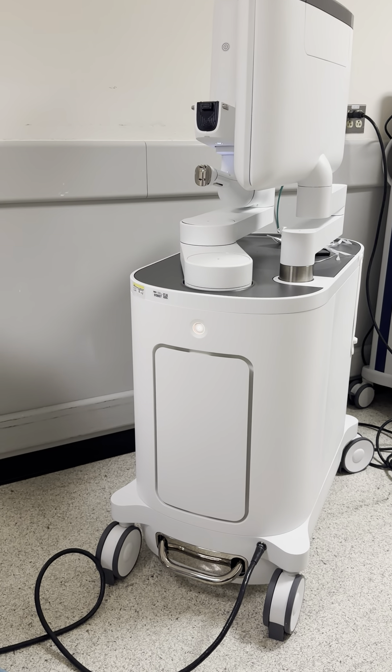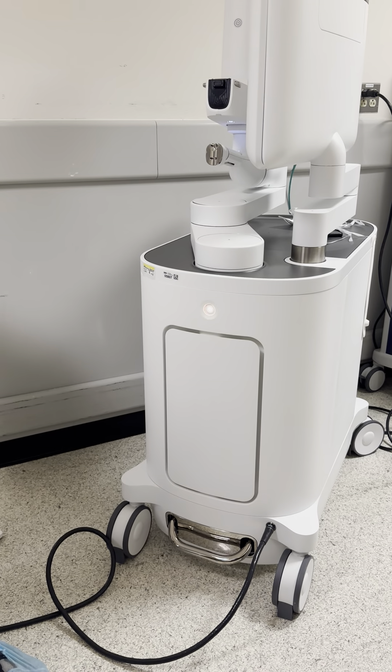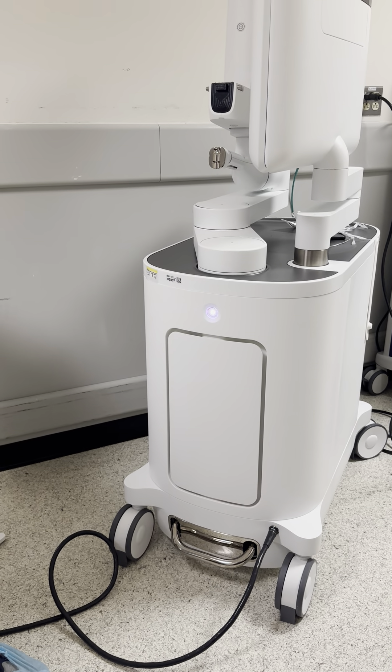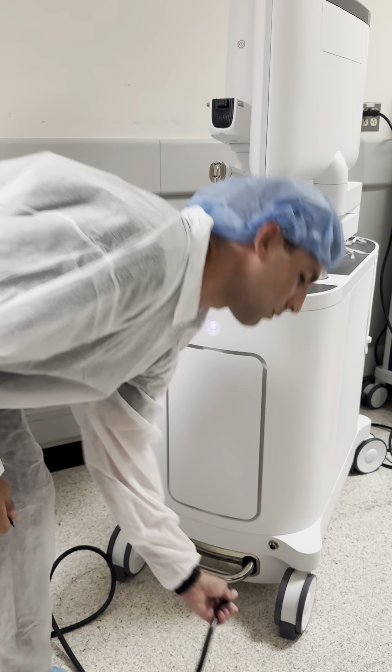At that point, once it turns white, you can disconnect the controller on the bottom right, right here, and you can transport it as needed to its resting destination. Remember to keep it plugged in at all times when not in use.